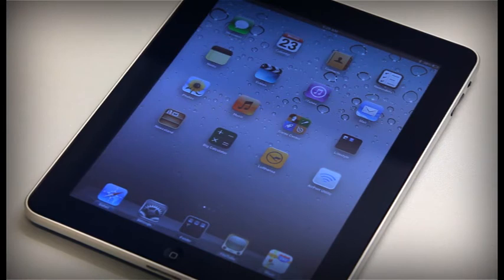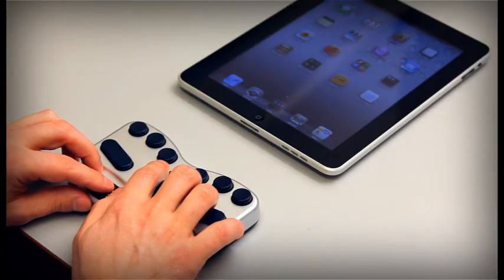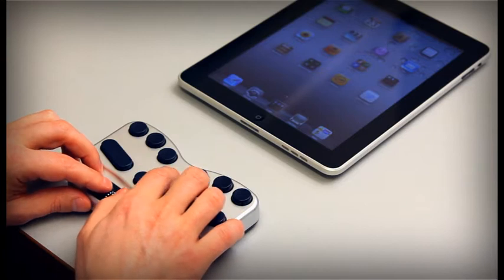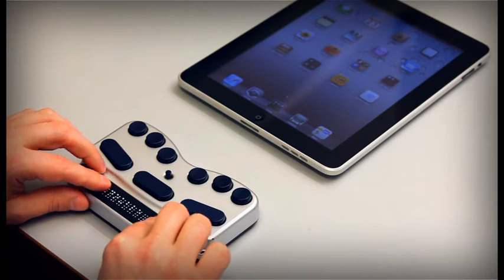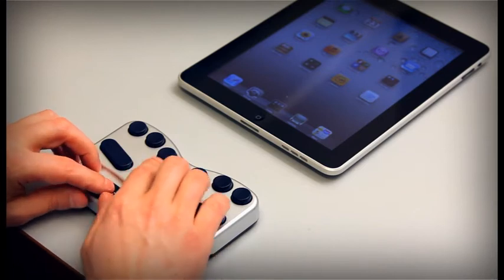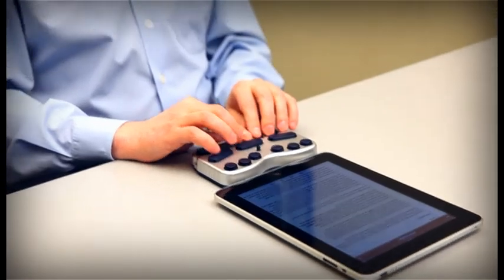When you land on Notes, VoiceOver will say Notes. Double tap to open. At the same time, your Braille display will show the word double with an 8-dot cell on either side of it. To open the app the cursor is on, press joystick enter. We're opening the Notes app, which is a standard app on any iDevice.